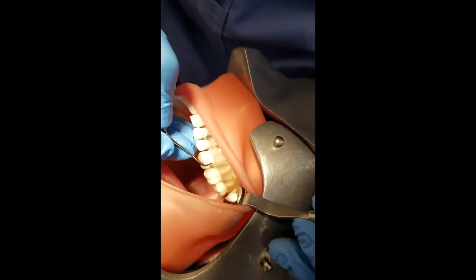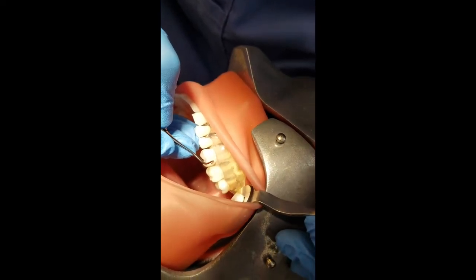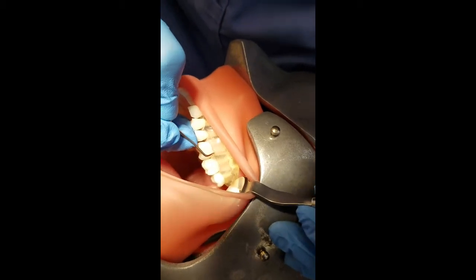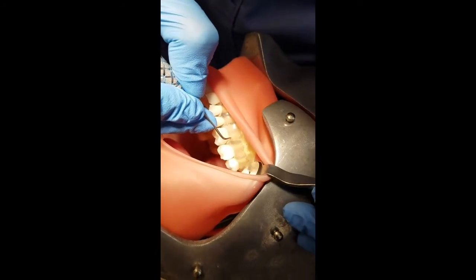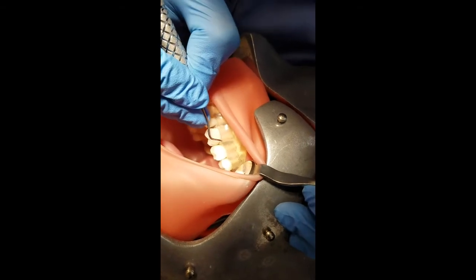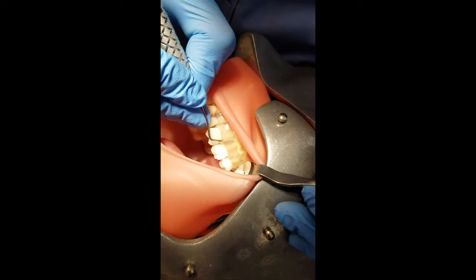With the tip third adapted to the tooth, distal rock with no lateral pressure to explore until the terminal shank is parallel or 90 degrees with the long axis of the tooth. You should see blanching of the tissue from the back of the scaler touching the free gingival margin. Then you will tip the terminal shank to 70 to 80 degrees towards the tooth in order to do your scaling stroke. You will activate lateral pressure using your thumb and index finger to scale.